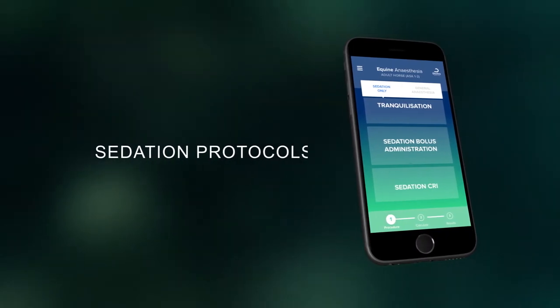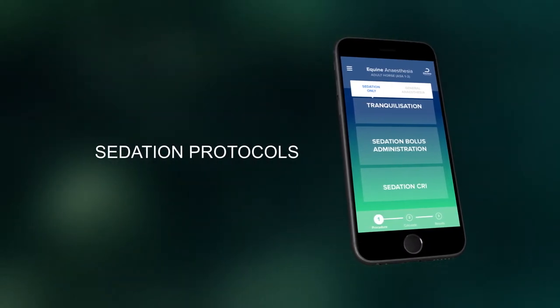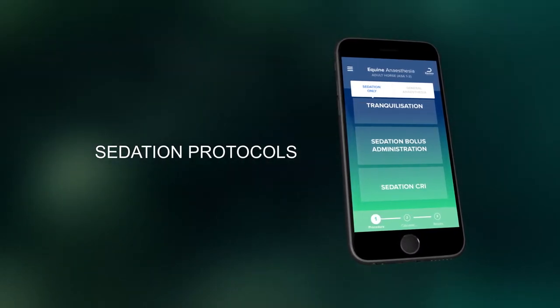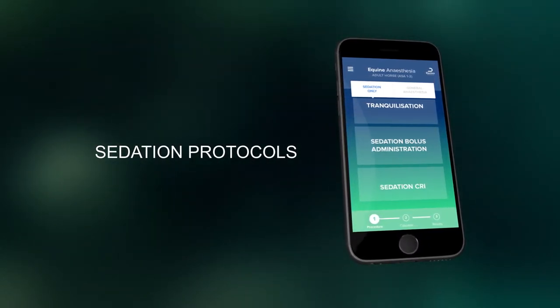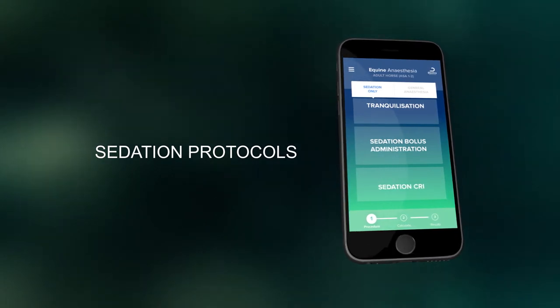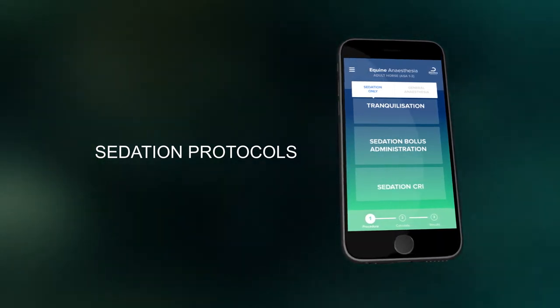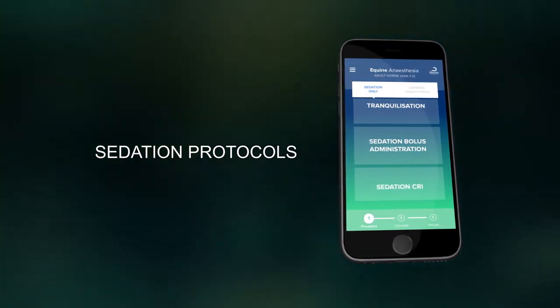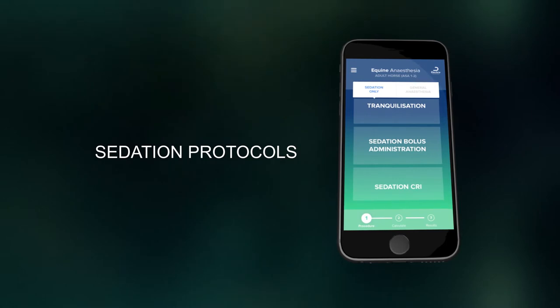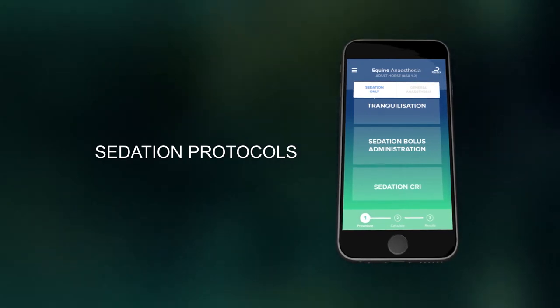Designing sedation protocols works in the same way. For sedation protocols, you can choose tranquilization only or sedation by either bolus administration or constant rate infusion, CRI.